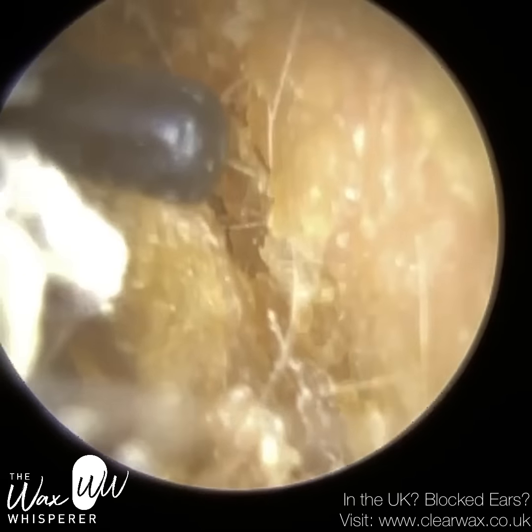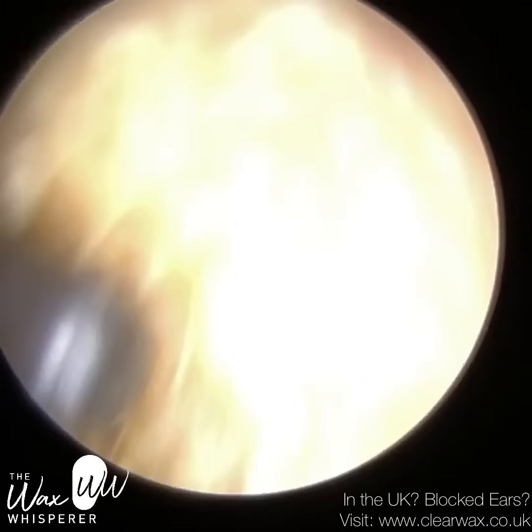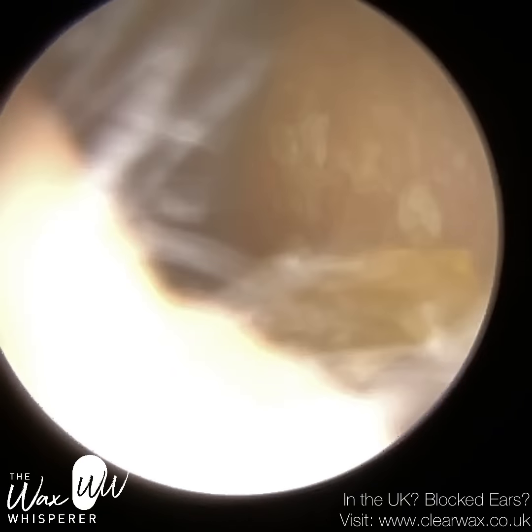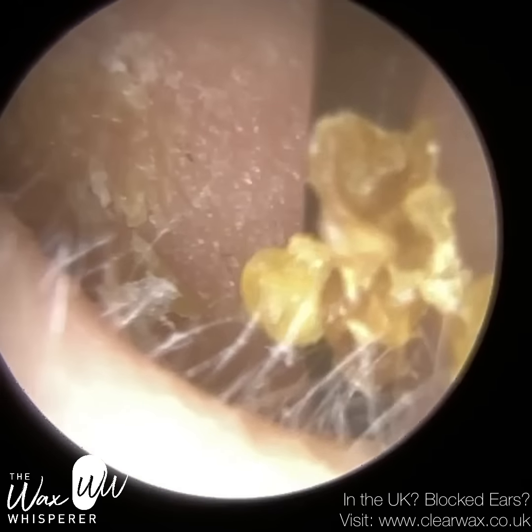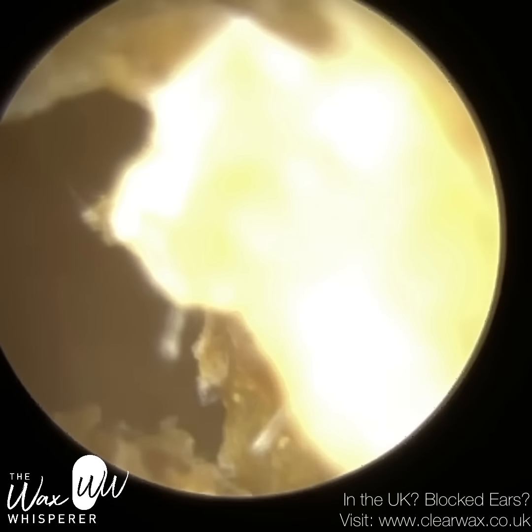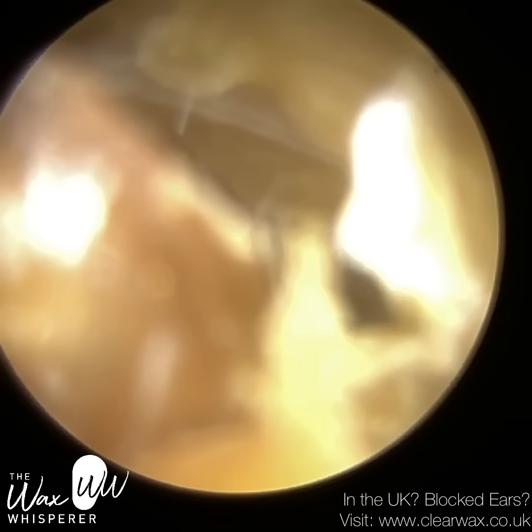function and properties. However, because of its reflective nature, when you're performing earwax removal, it can reflect the light that we're illuminating within the ear back towards us. So it can make things a bit bright at times. We can adjust that actually using the iClearScope. We can adjust the exposure, so the brightness level, but it wasn't causing me too much of an issue. But I just thought I'll explain why it's quite reflective.